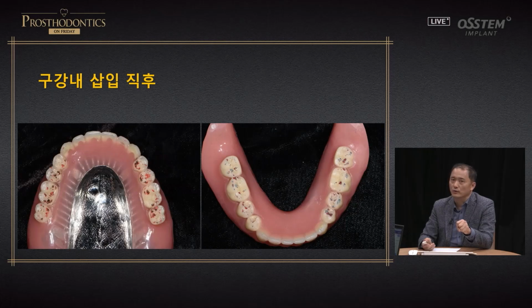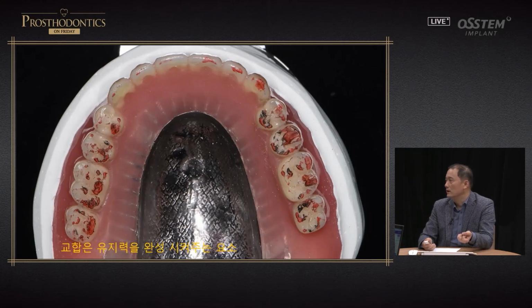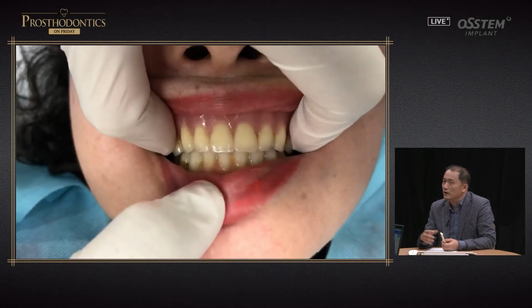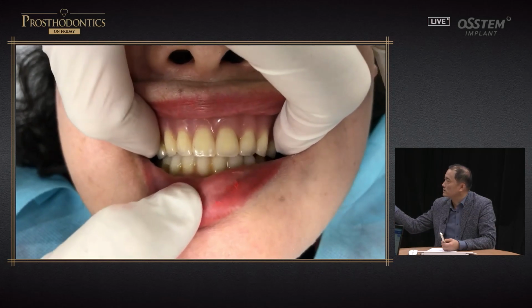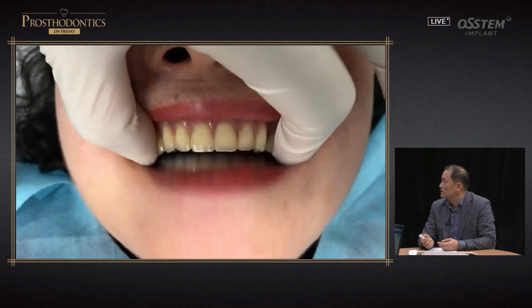So even orally, just because mounting is finished, don't deliver everything. Fine-tune everything again for the occlusion. This is very much included: making the occlusal adjustment. And how much occlusal adjustment do you need to do? She's been wearing a denture for 3 or 4 years, and it's really shaking left to right.